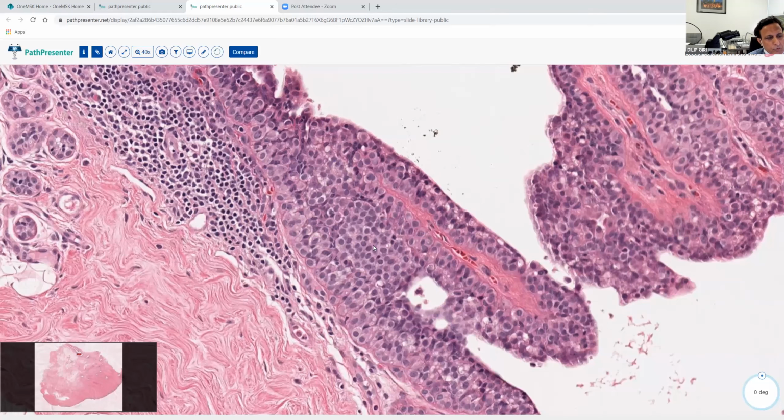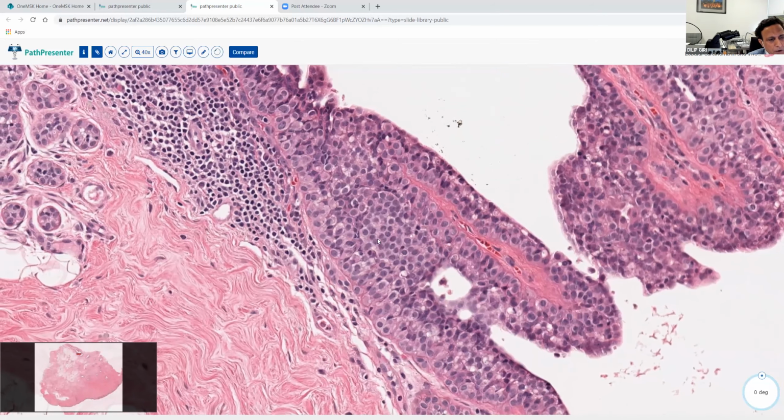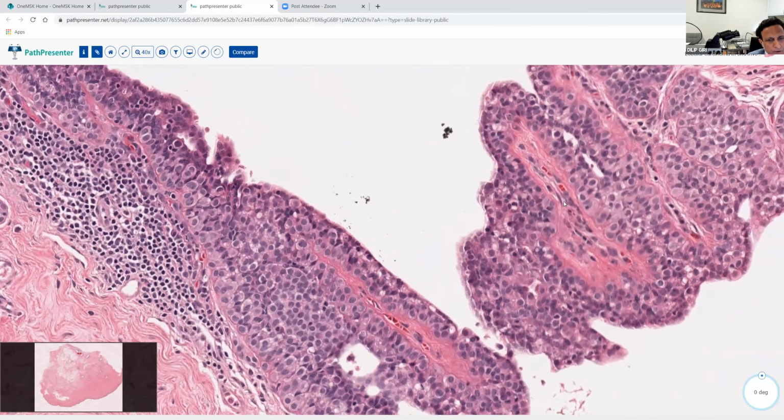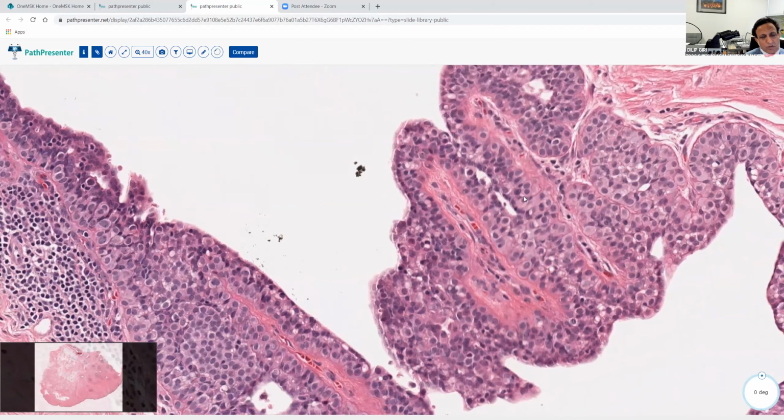That determination has to be made on morphologic grounds. Now, once in a while we all tend to accept that Pagetoid extension equals LCIS involvement of a duct, right? I mean, that is what we learned as undergraduates, and maybe even most of the time, our attendings, in the beginning of our training, may have told us, yeah, LCIS has Pagetoid extension.